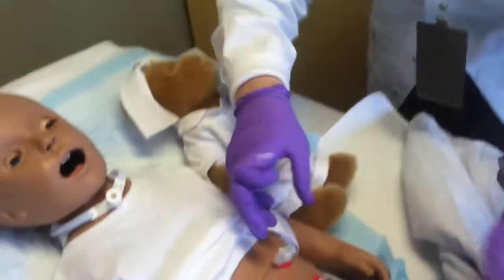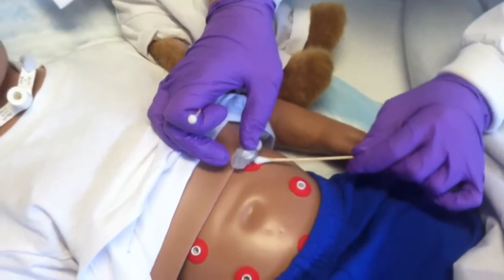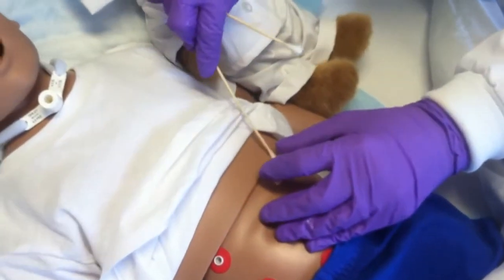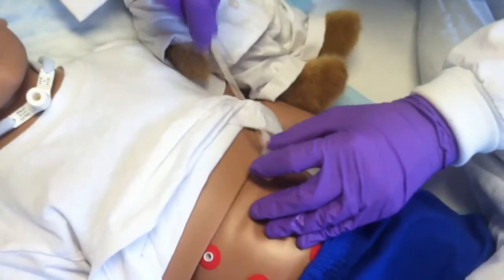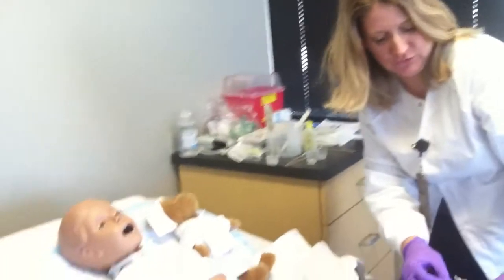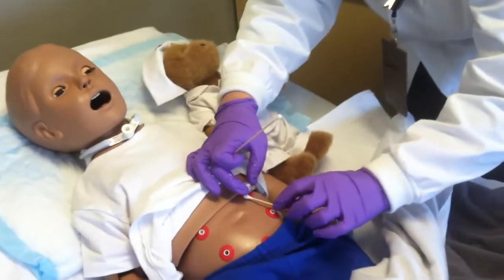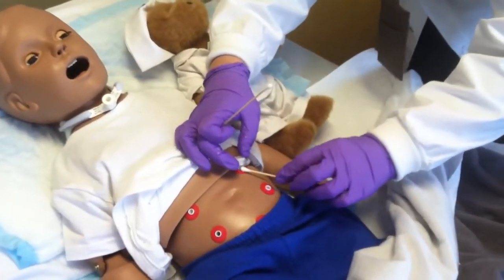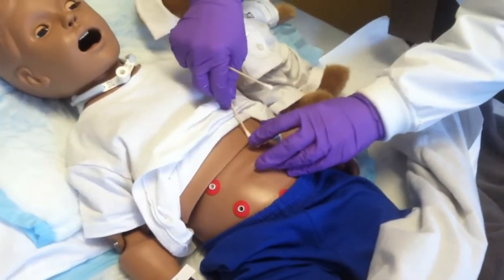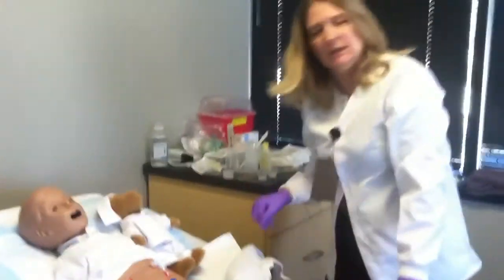Now we have to rinse all that soap off. So take your next 2 Q-tips, tilt the G-tube up, twirl all that soap off, get it right next to the tube. And then tilt down and you do the same thing on the top half, twirling and rotating. You use very little soap and water. The last thing you're going to do is you have to dry it. So you're going to take dry Q-tips and do the same thing in a rotating, twirling motion on the top and on the bottom. Okay? And that's how you do it. It's really simple. It doesn't take very long.